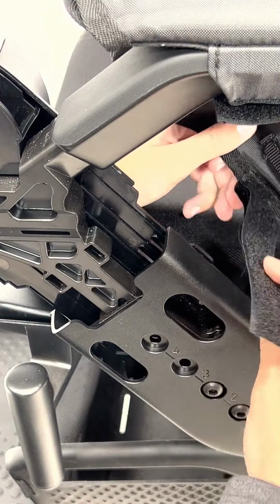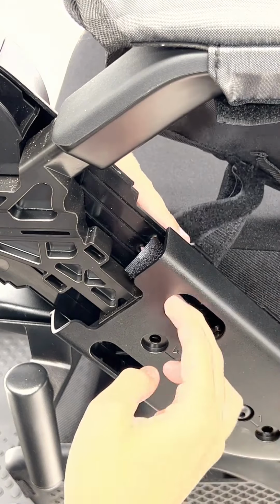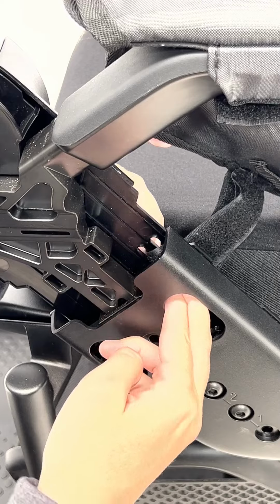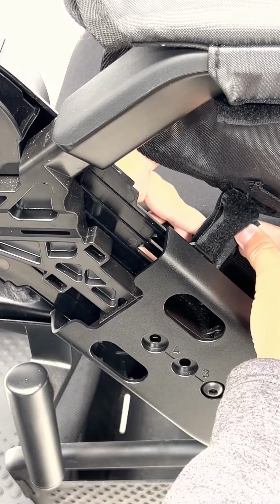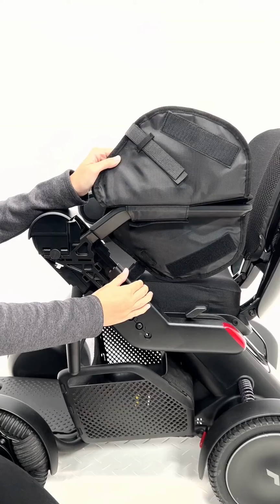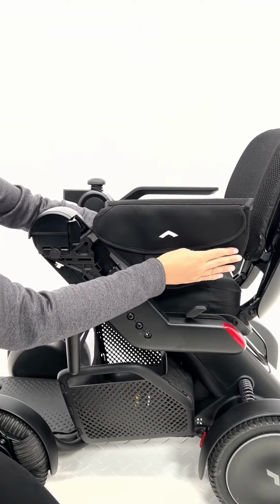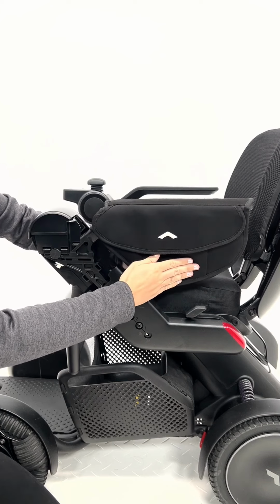Then take the long skinny strap attached and thread it through the designated slots on the wheelchair frame. Close the Velcro pieces at the bottom, ensuring they are securely fastened to each other.